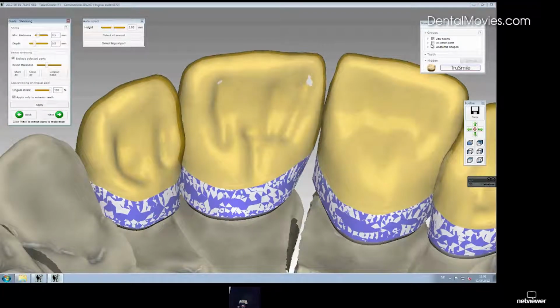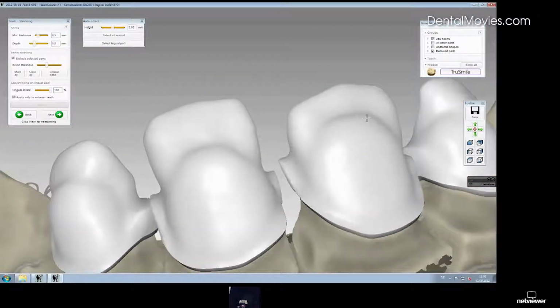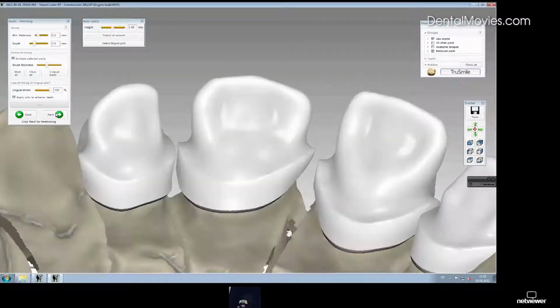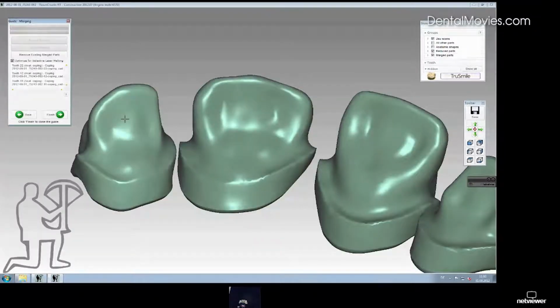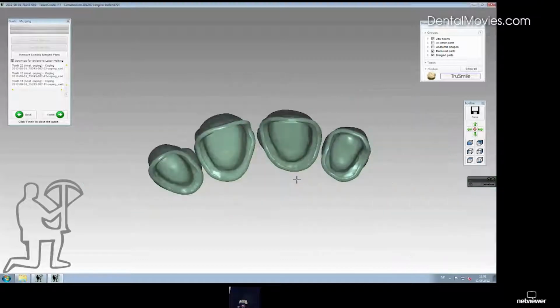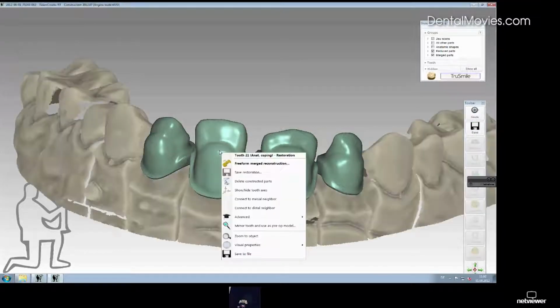So here's the same shrinking. You can exclude some parts and make a lingual band, for example. And all other parts are shrinked, except these areas here.